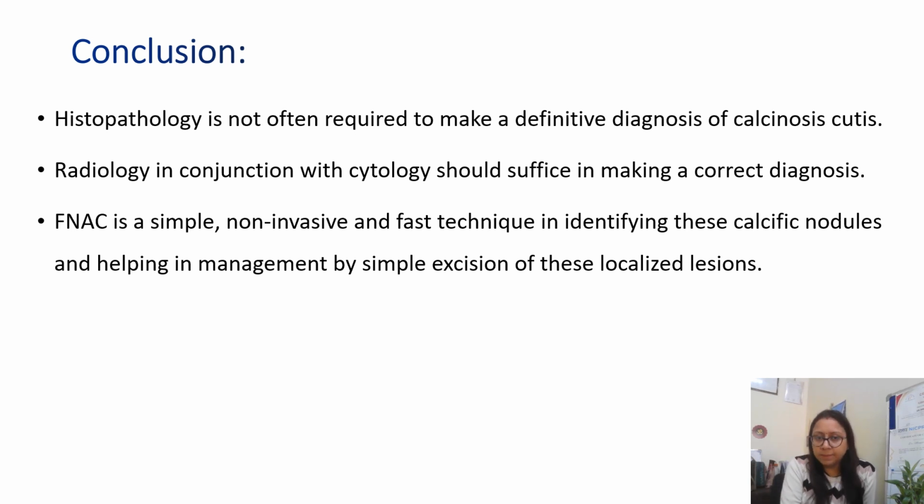We got the biopsy. But in all 12 cases we did FNA. That was all FNA-proven calcinosis cutis. So histopathology is not required to give a definitive diagnosis of calcinosis cutis. Radiology in conjunction with cytology should be sufficient to make a correct diagnosis.